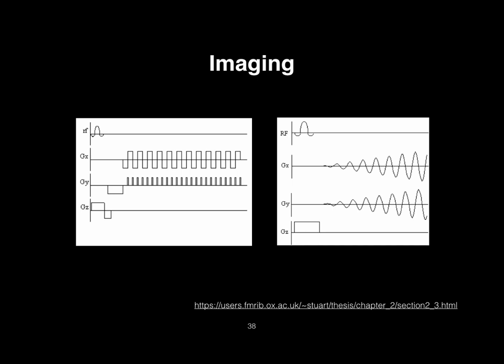Okay, so if our scopes are on, the next time you go into a suite, you should see something resembling this very closely for EPI. There's not a lot of spiral done here, but there are a couple of sequences that have it embedded. So those are the kind of waveforms you should see.